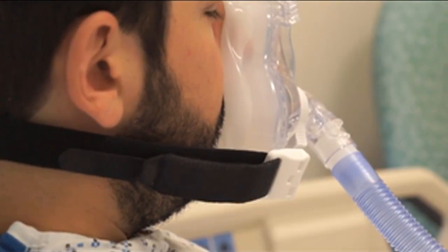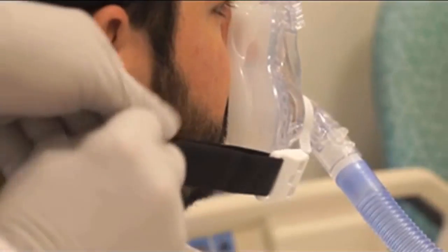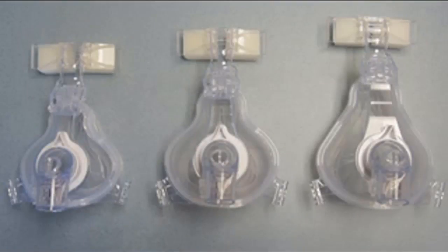If the patient is uncomfortable or if a large air leak is noted, reposition the mask or change it to a different size or type.